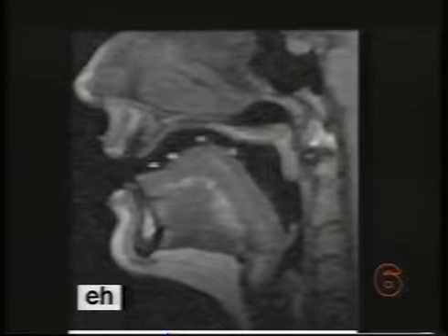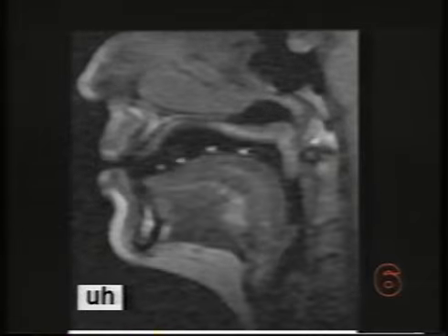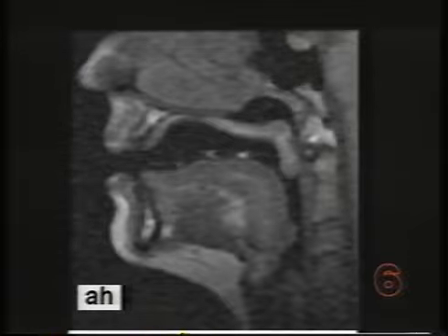MRI is a rapidly evolving technology. There is currently no standard for using this methodology in speech research. Although acoustic limitations remain, the reduction of acquisition time and the advances made in gating images to specific speech events make this the most promising technology for obtaining quantifiable data on the structural composition of the vocal tract. In addition, advances in functional imaging technology provide an avenue for exploring the relationships between central control of speech movements and the actual speech events.